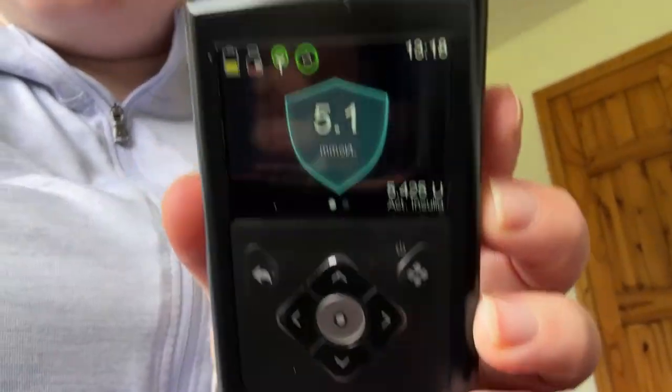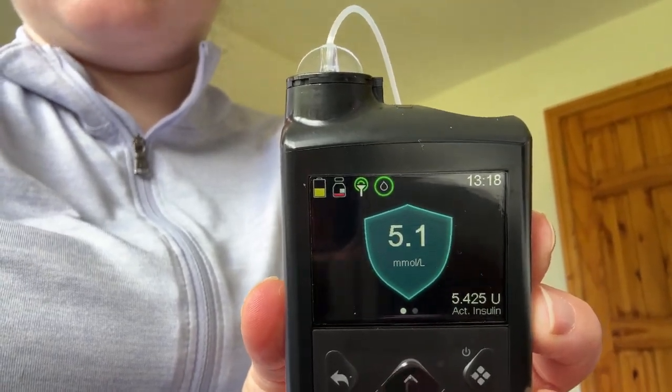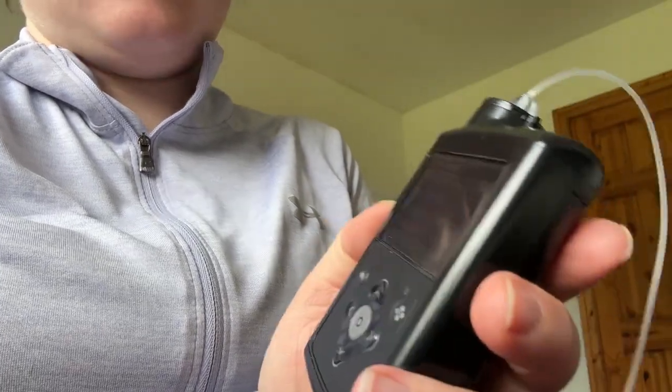I'm just back home and just finishing my walk. The pump says 5.8 which is perfect, and I still have some time left on the temp target. I'm going to go in and have my lunch. After lunch with 64 grams of carbs, my blood sugar is 4.8 — actually 5.1. The temp target has finished. I think that walk was successful — I'm in range, not high, not low, and I'm very happy with that.